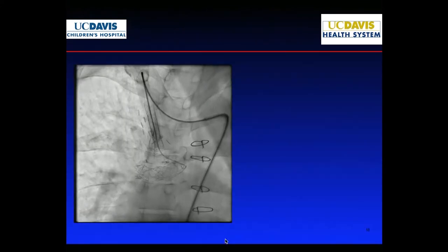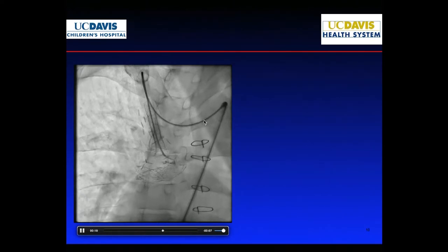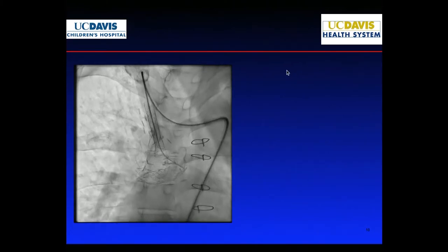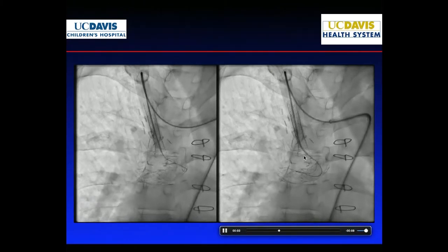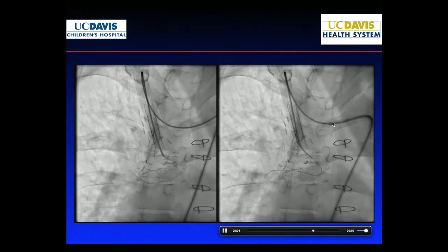So I'm just showing you some of the times. See how when you're pushing, this is just with a catheter going through. Here's a catheter with a wire, and instead the sheath just backs up. So again, when you have lots of curves, it is very difficult to maintain stability of your coaxial system because of the curves. And there were 3 or 4 curves here. So as you're pushing this catheter, we're able to get the catheter down here, but see how every time you push a little bit, the sheath backs up.